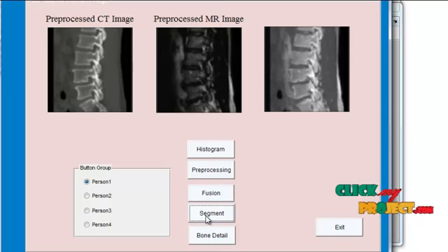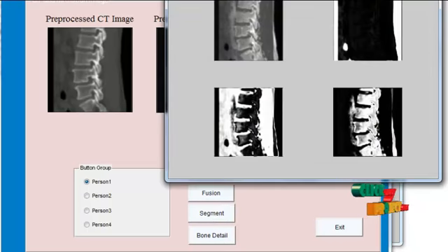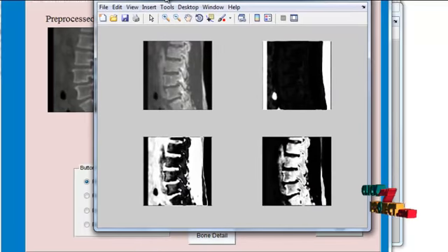This new figure displays the segmented images. The final segmentation displays the clusters. The first image is the fused value, and the other images display the first cluster, the second cluster and the third cluster values.